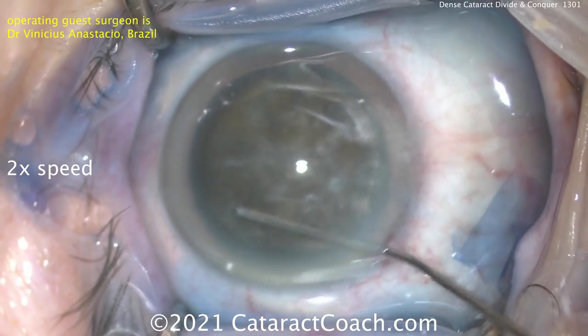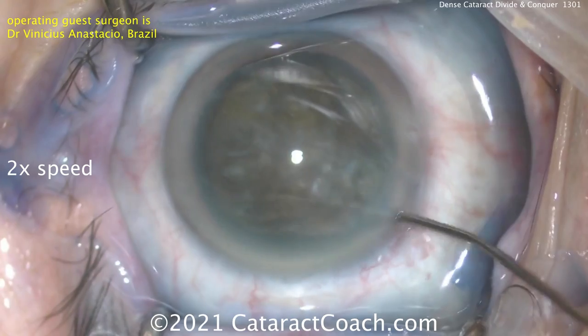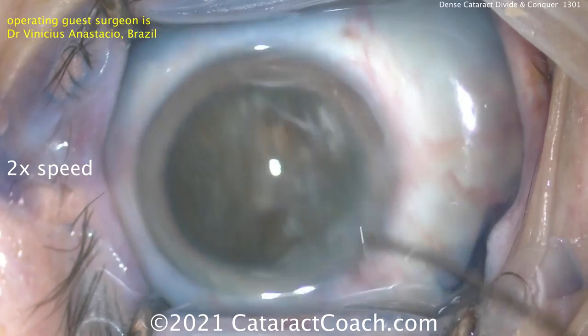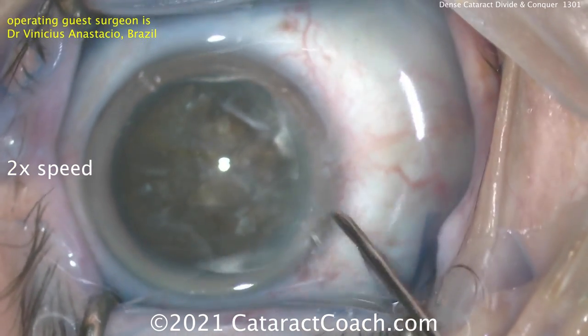You can see this is very brunescent, very dense. Trying to loosen up that nucleus, see if you can get it to spin. Be careful if you do hydrodissection here because you can't really see the fluid wave going across. You've got to look at the very subtle clues of whether the nucleus comes forwards.